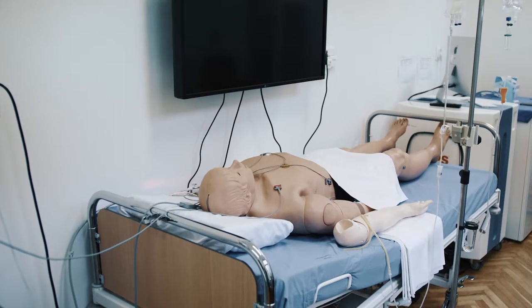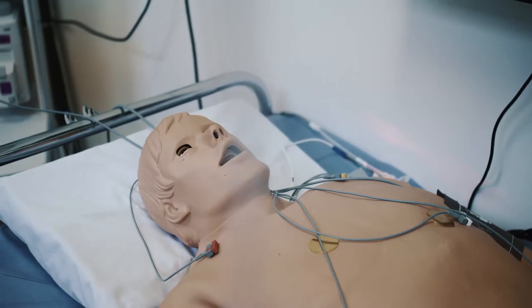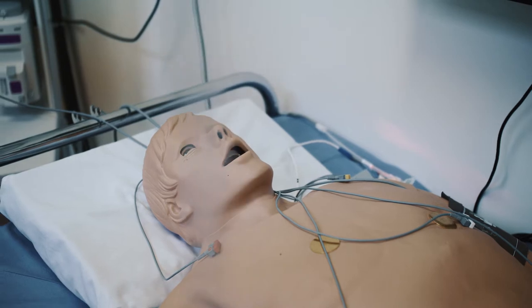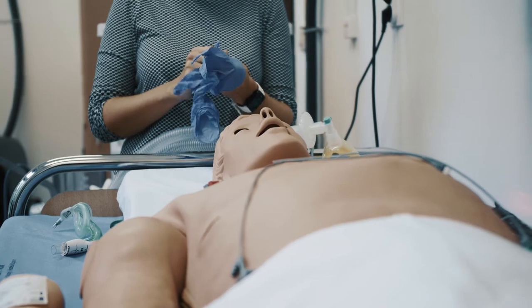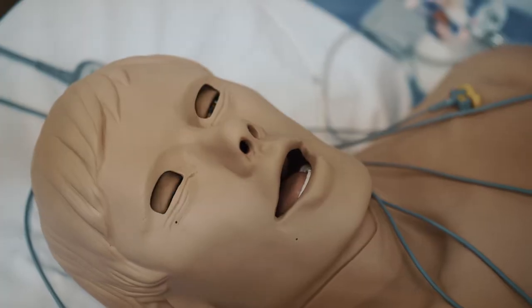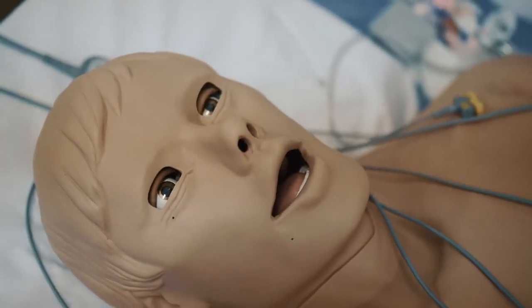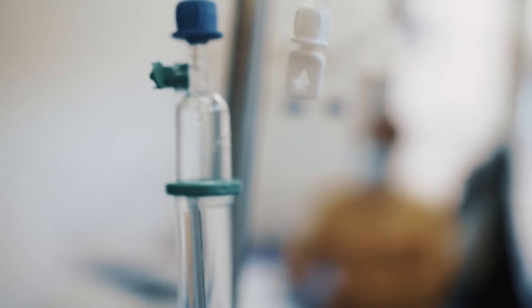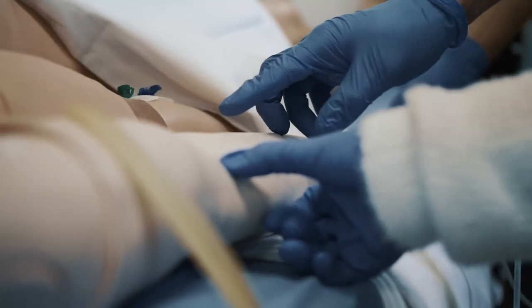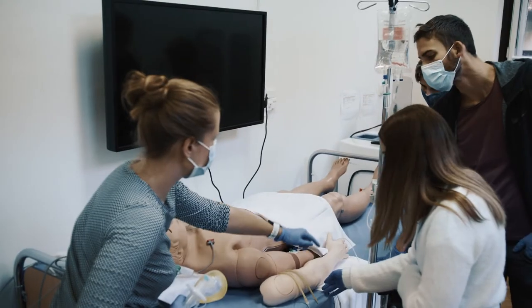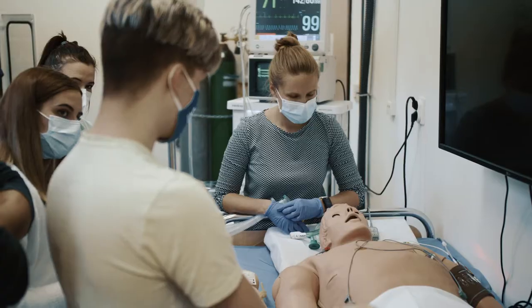The human patient simulator is a high fidelity simulator unique in Europe. It is mainly used in undergraduate and graduate anesthesiology education. The pupils of the phantom narrow to light, it can also be the subject of mechanical ventilation, and it has palpable and measurable physiological parameters.